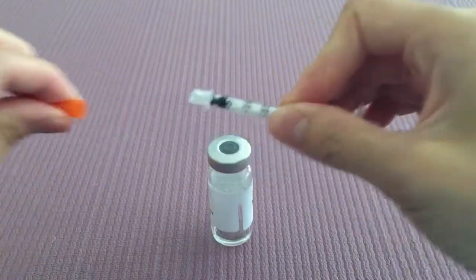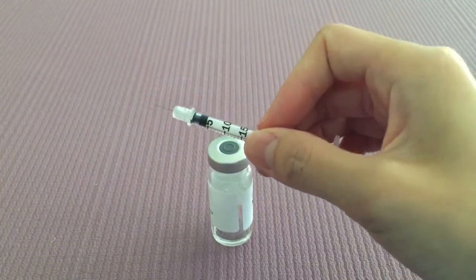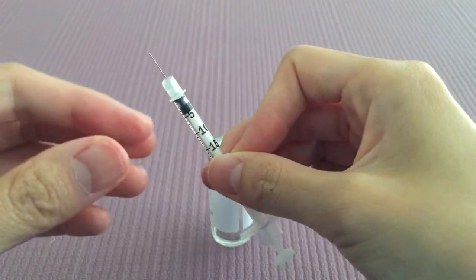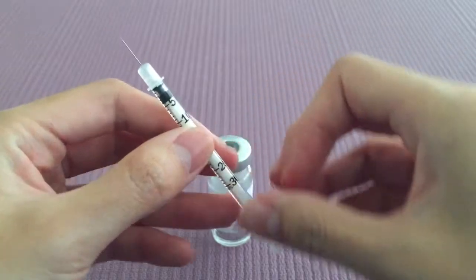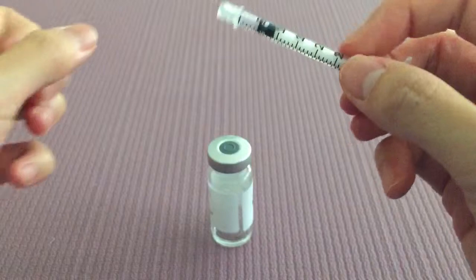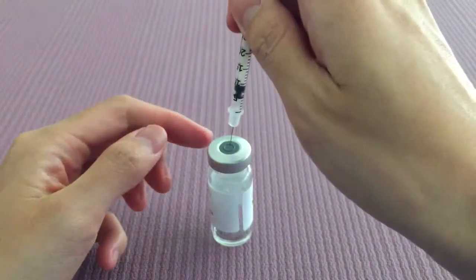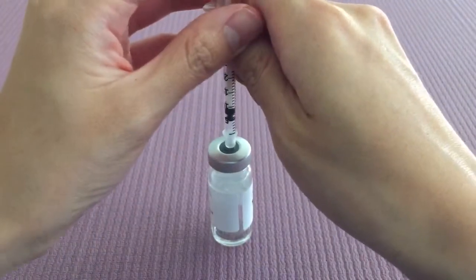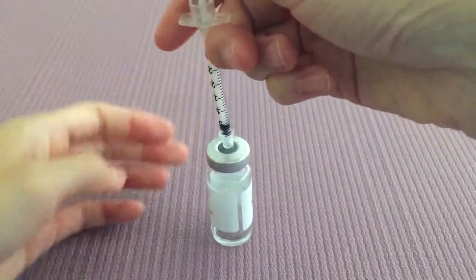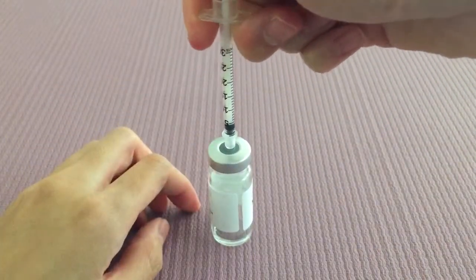The first thing you want to do is draw up air into your syringe. So depending on your dosage, let's just say it's five units of Micro HCG. You're first going to pull it up to the five mark of air and then you're going to inject this into the vial. The reason why we do this is because inside the vial it's usually highly pressurized and this just helps to drop the medication a little easier.